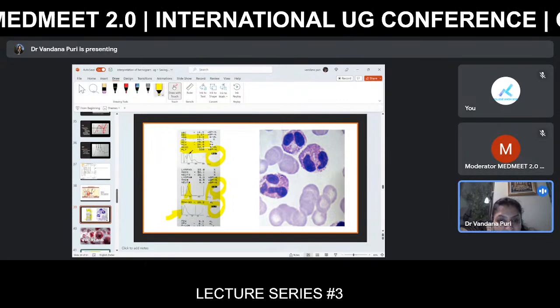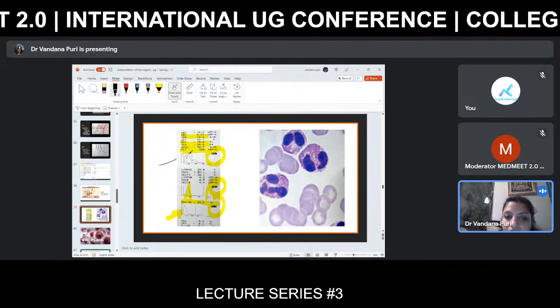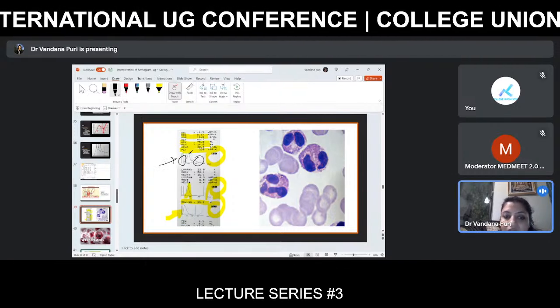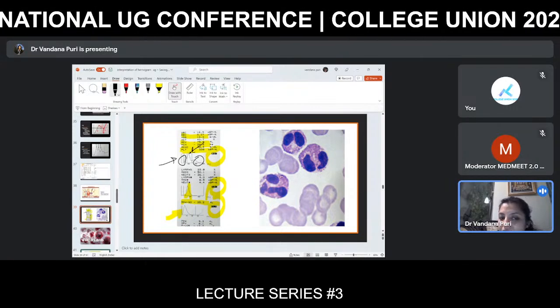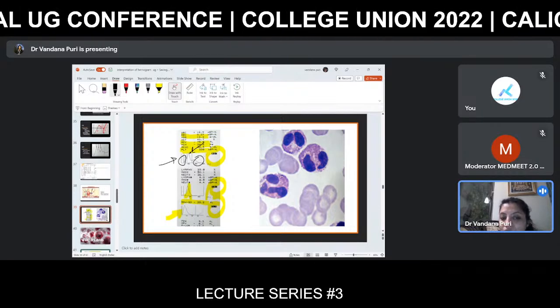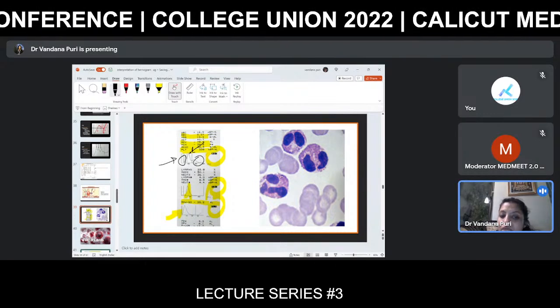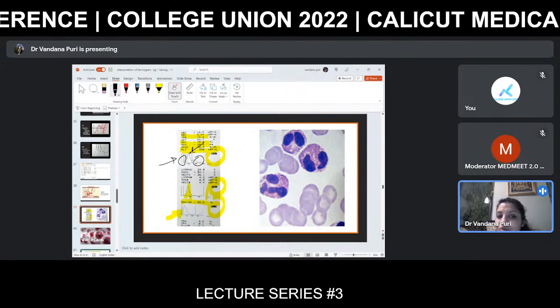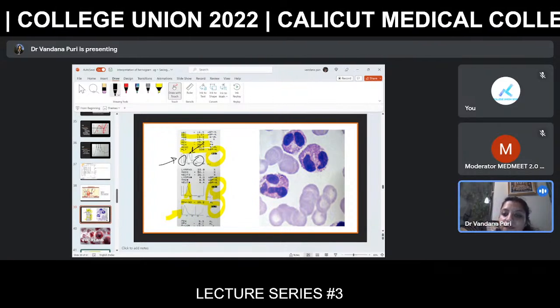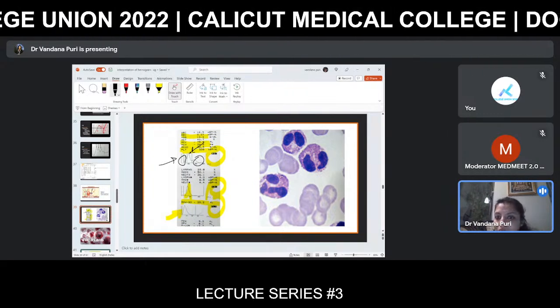Now let's come to the WBC histogram. When you look at it, all of you can see the smallest cell, lymphocyte, and the neutrophil, and this middle peak is very high. Normally, which cells are the predominant cells in your body? They're neutrophils. But here you can see the mixed population is very, very high. So definitely the mixed cells are increased. Because this is a three-part Coulter, it can give you just three populations: lymphocyte, neutrophil and mixed. So you have to go to the smear to see what is increased in the mixed.